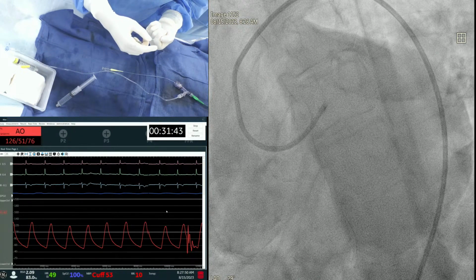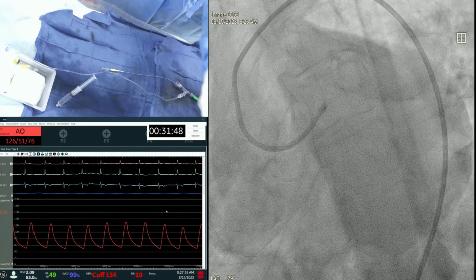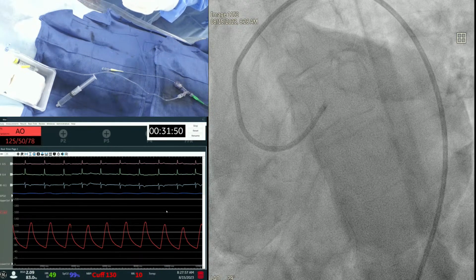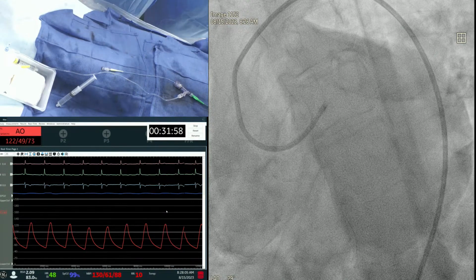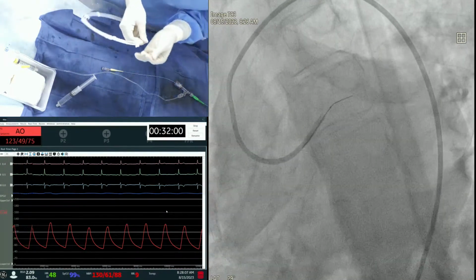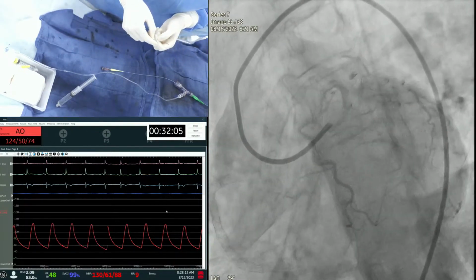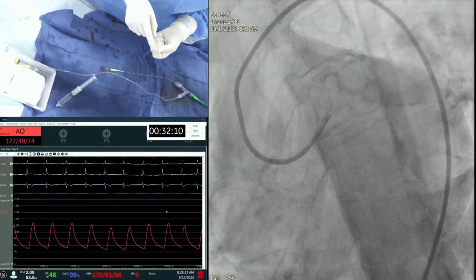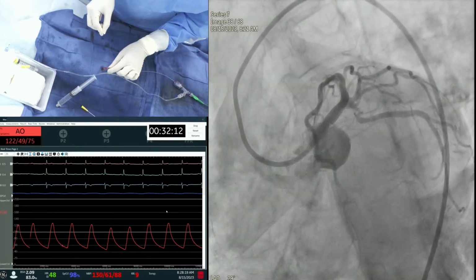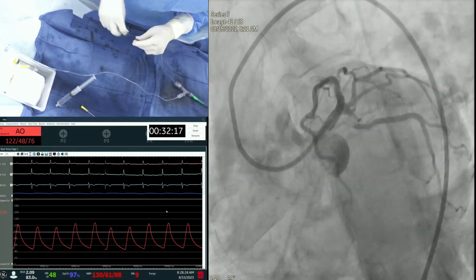Just coming back to the point somebody made, use the cutting balloon. Once your wiring is so difficult, it's not going to help. Nothing will go there. So the key is you plan all these things ahead based on your experience. People may say, I will try a balloon, but look at the calcium in that lesion. If that were a straight segment, IVL would have been fantastic, with lower complications and very low perforation risk. But in this kind of case there will be a delivery issue with IVL.